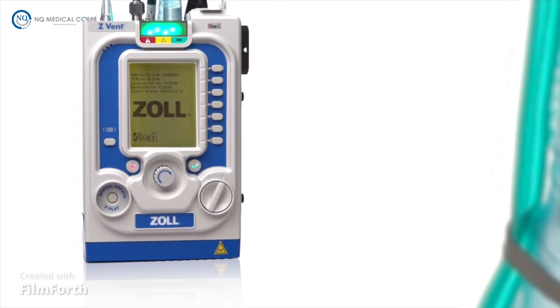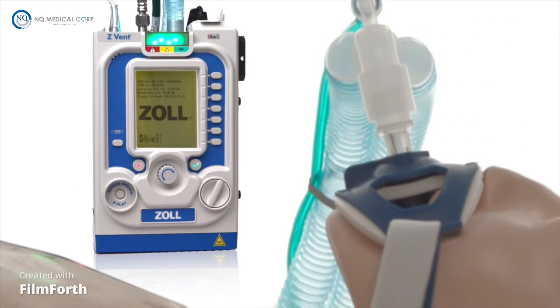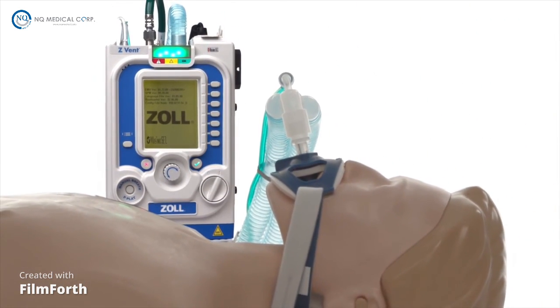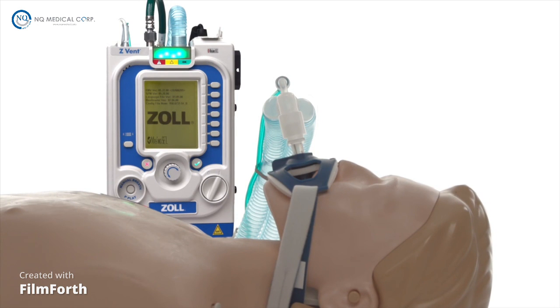We have now completely reviewed the parameter windows and how to change basic settings. Throughout the other modules, we will continue to explore the device's functionality and how to prepare the ventilator for use.